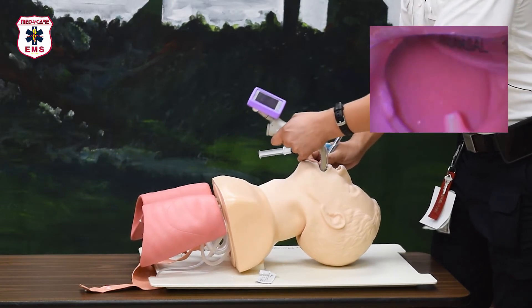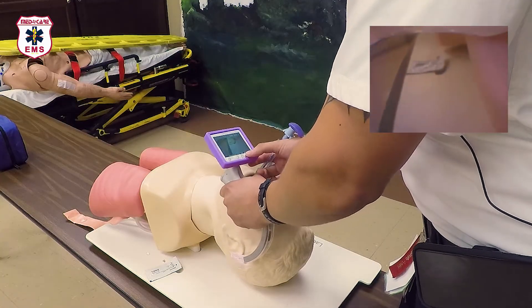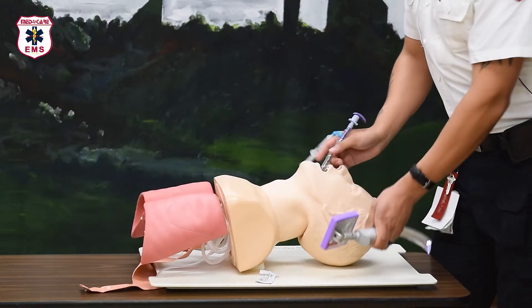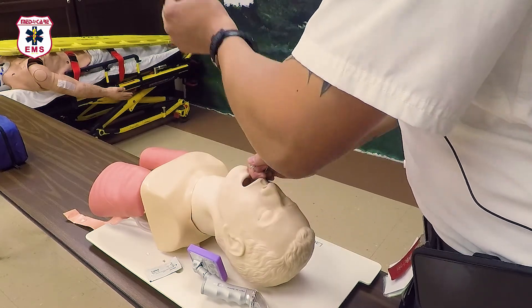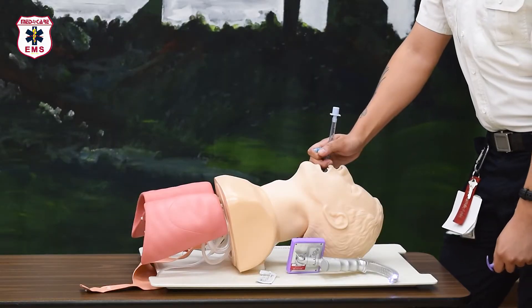At this time, carefully remove the video laryngoscope from the mouth and use your thumb to hit the record button again — this will stop recording. Set the scope aside in a soft and secure location. Inflate the ET tube cuff, remove the rigid stylet, verify your placement, and secure as you normally would.